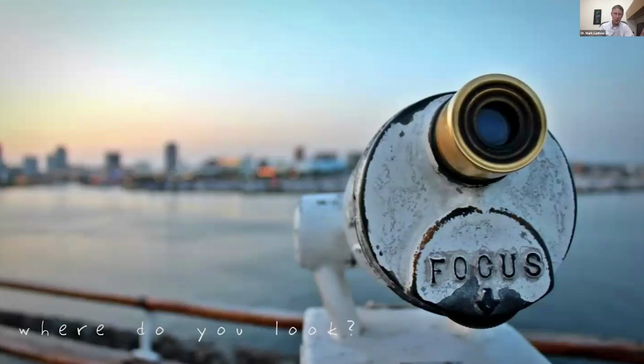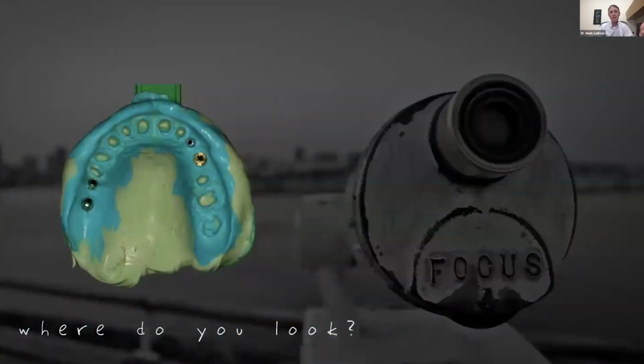Second thing is, and this is kind of from the beginning perspective, is figuring out where in the world you're supposed to look. When we take conventional impressions like this, we all know where we're looking. We're using terrible posture. We're going down like this. We're injecting in. We're seeing everything with direct sight. And that's where we look.